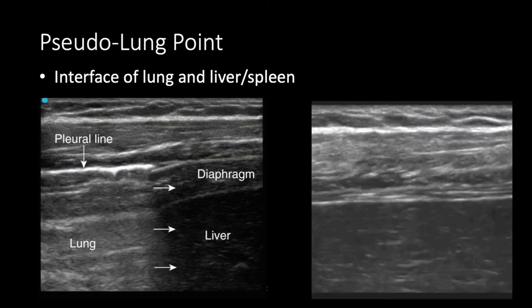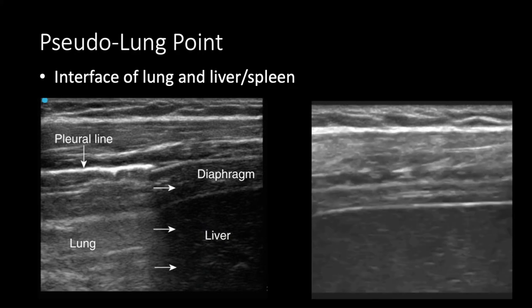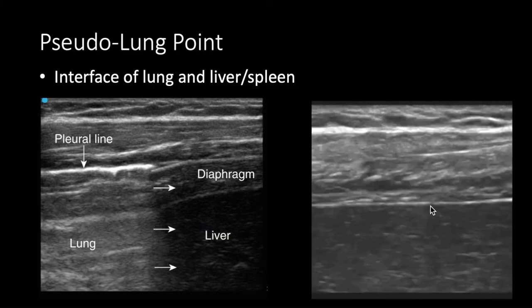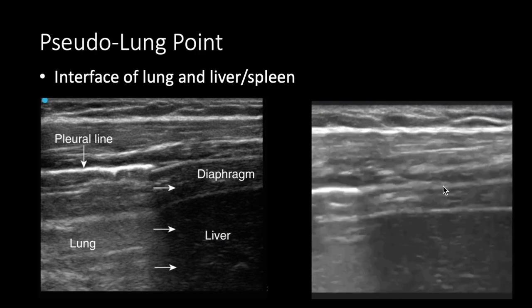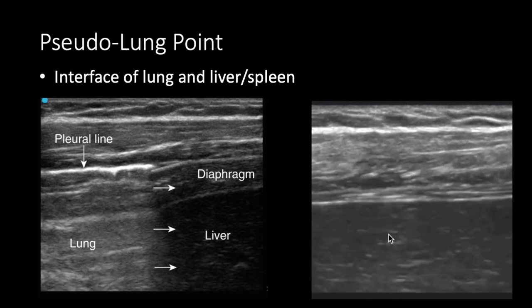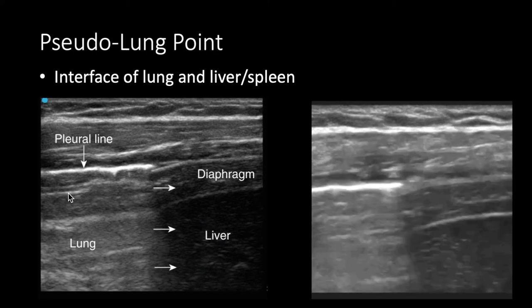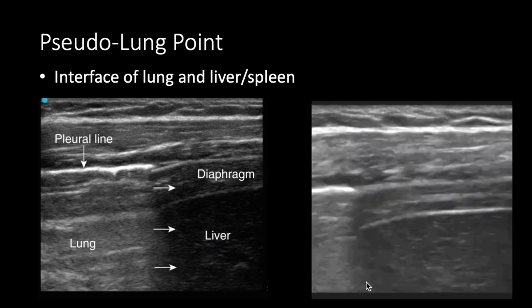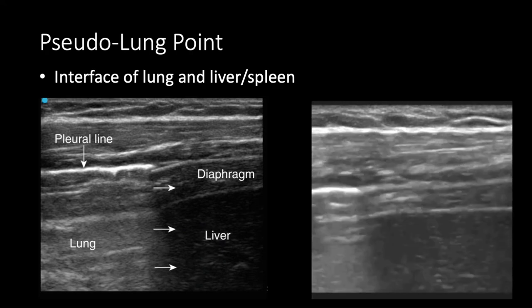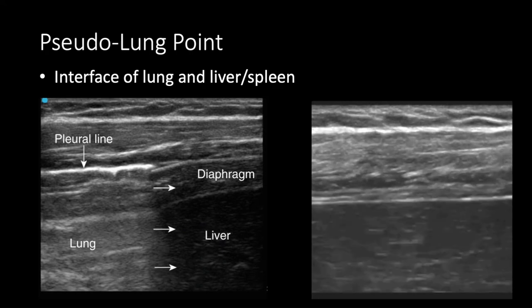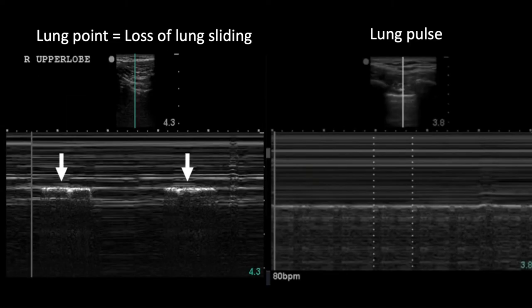One caveat: if you get close to the diaphragm and below the nipple line, you may think you're seeing a lung point due to the alternation of lung and tissue — but this is actually the liver and diaphragm interacting with the lung. So be careful, and make sure you're not by the diaphragm and seeing the interface of abdominal organs with thoracic organs. Here's a nice look at a true lung point on M-mode where you see granular beach, barcode, granular beach, barcode.